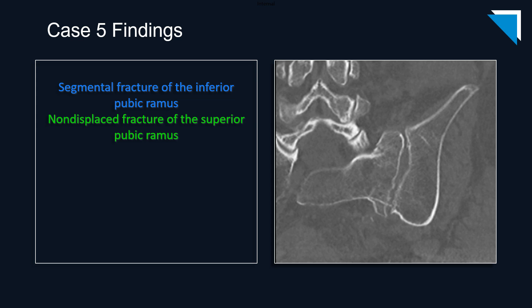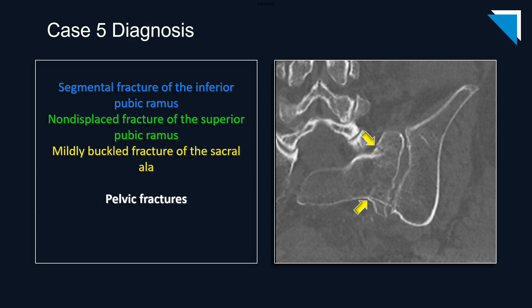And on this coronal image, a buckled fracture of the sacral ala is evident. Isolated pelvic bone fractures are somewhat uncommon, so you should always look for a second and even a third fracture if you see one. It's very common to see superior and inferior pubic rami fractures, but in many cases there are also fractures of the sacral alae, so it's important to include that region in your search pattern.